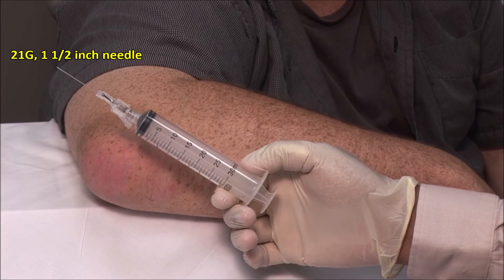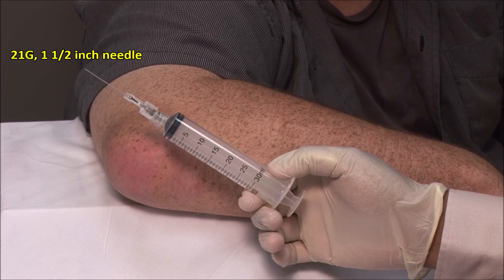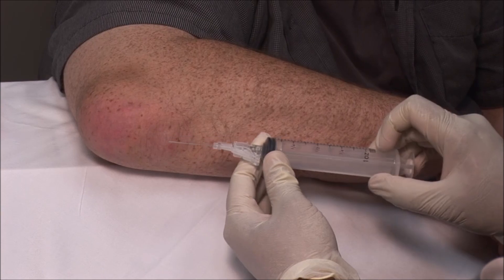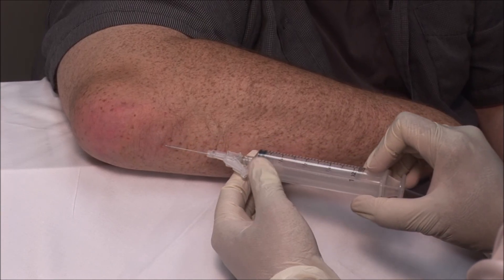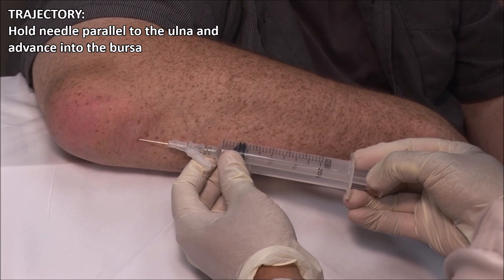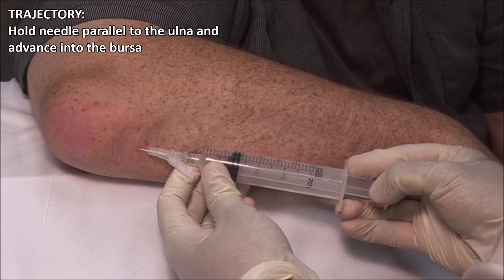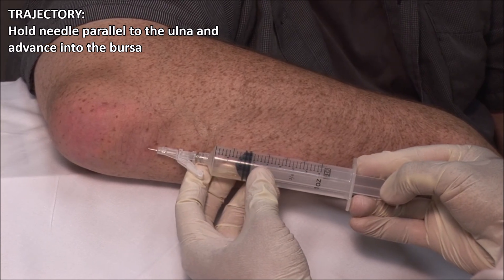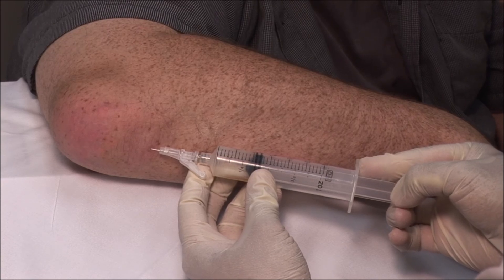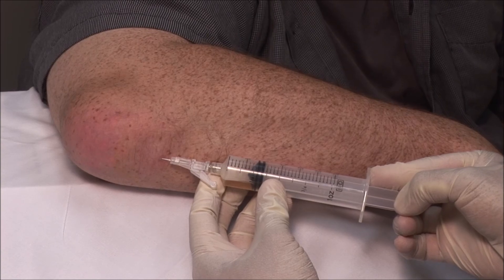I am using a 30 mil syringe with a 21 gauge 1.5 inch needle. Advance the needle into the bursa while aspirating. The fluid is coming out quite freely.